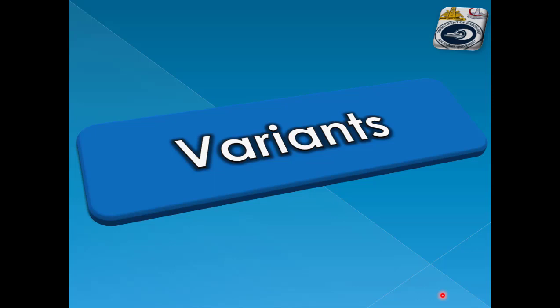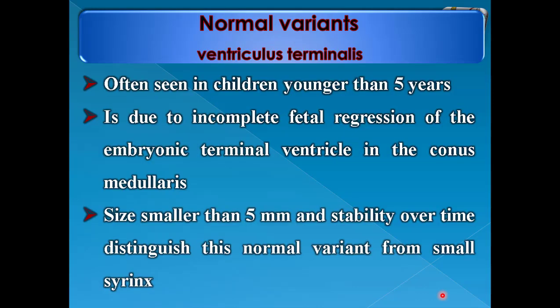We should know there are some normal variants in appearance that should not be misdiagnosed as pathology. The first of them is ventriculus terminalis, often seen in children younger than five years old. It is due to incomplete fetal regression of the embryonic terminal ventricle in the conus medullaris. Size smaller than 5 millimeters and stability over time distinguish this normal variant from a small syrinx.